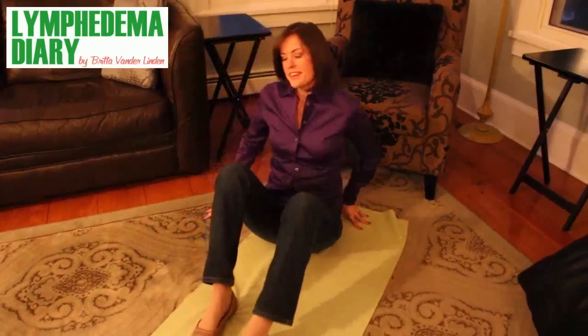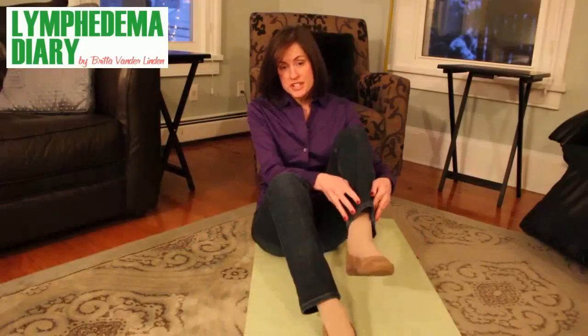Being on the floor gives you greater stability while you're putting on your stockings — there's nowhere to fall. And it also gives you better leverage. You can use your legs to push into your stockings away from you while gripping the stockings with your arms and pulling them towards you. And this mat is a great place to do a few stretches before you put your stockings on or after you've taken them off.